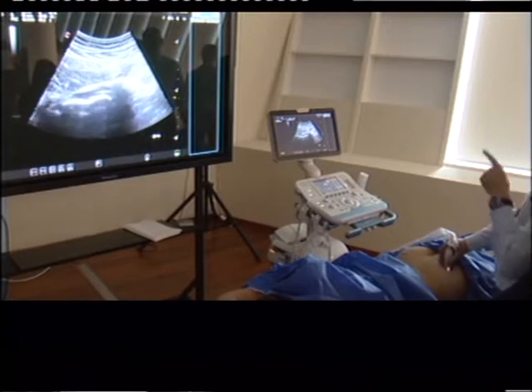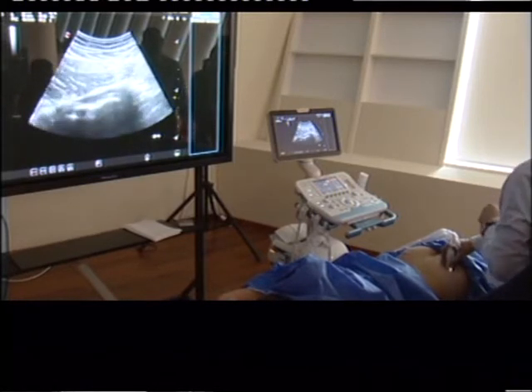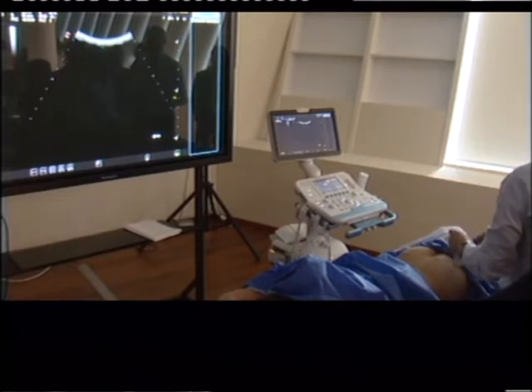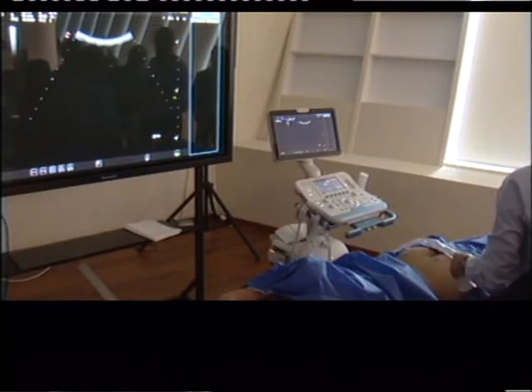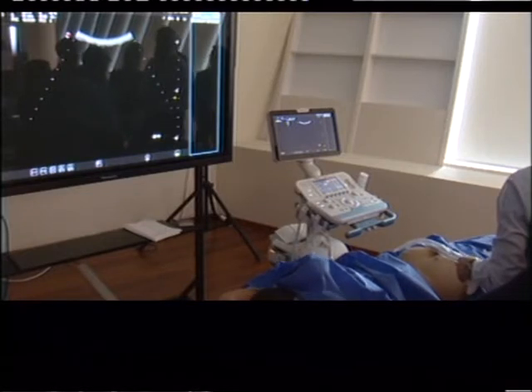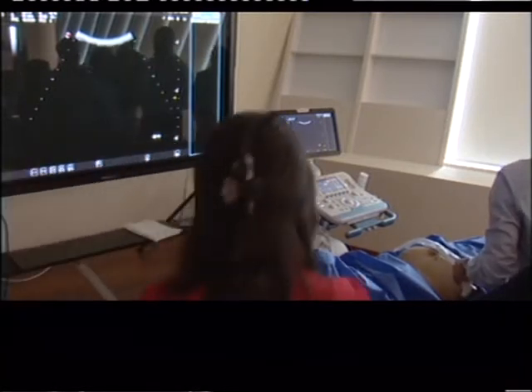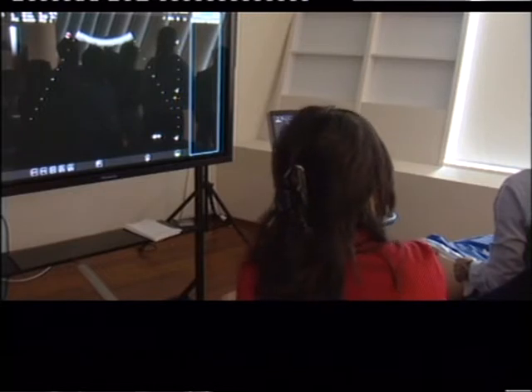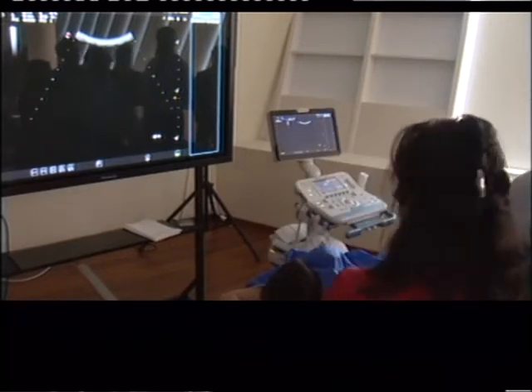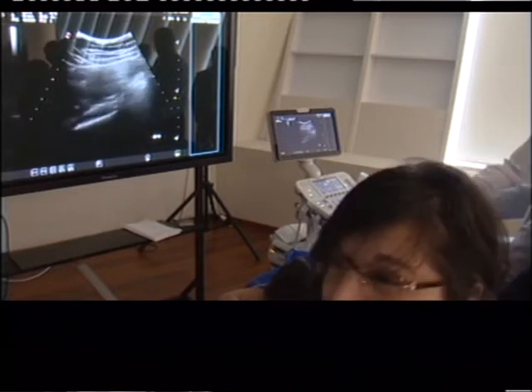And when you treat pudendal, you have seen before what you think was piriformis syndrome, after you think this is obturator syndrome, you needle the obturator muscles from this approach, with this needle.